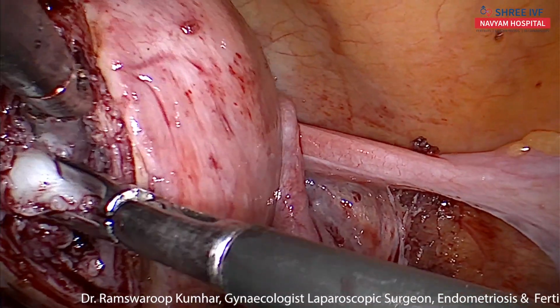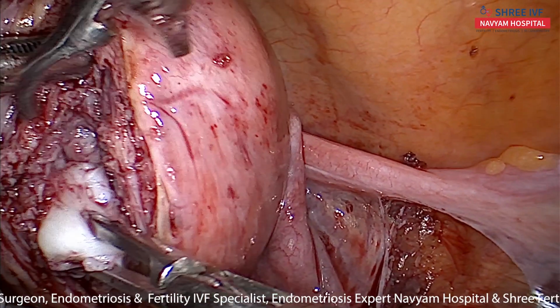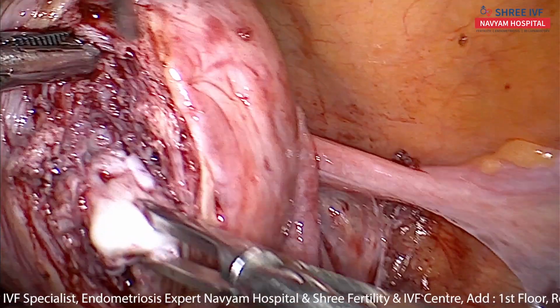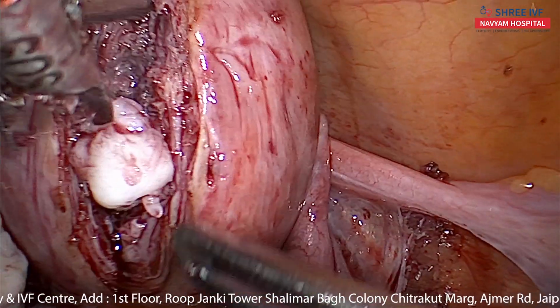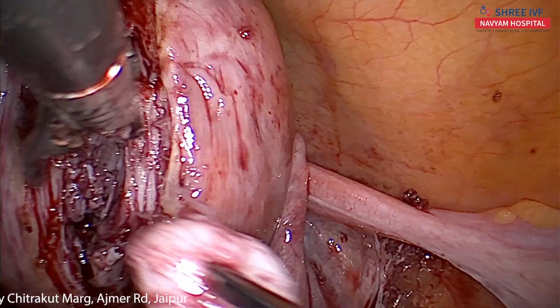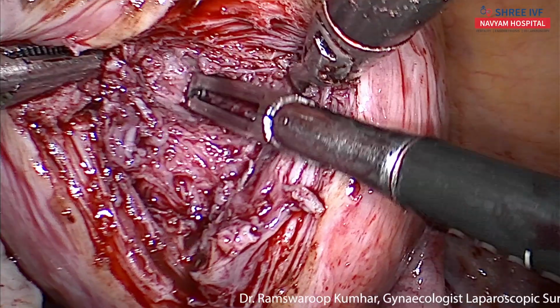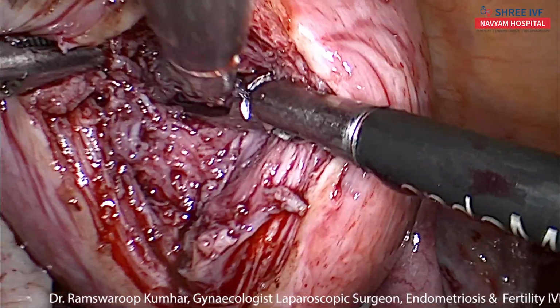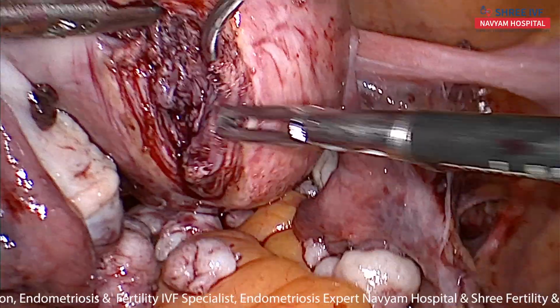I think there is another one or not. But no, this is the cavity. Oh, this is the cavity, I think. Let's see. This is the cavity. This is the cavity. Oh, so we have not opened the cavity.